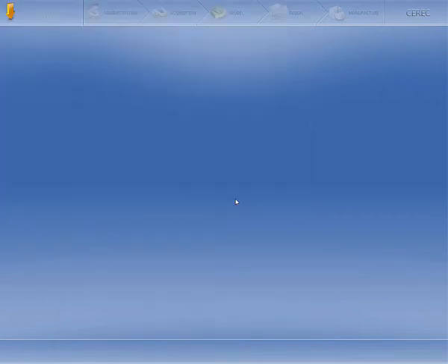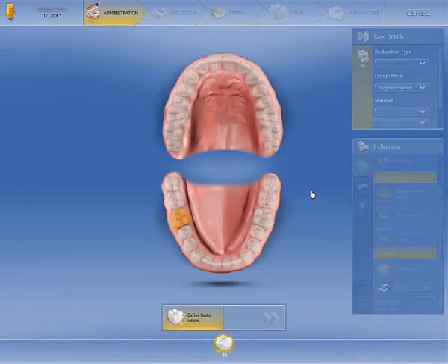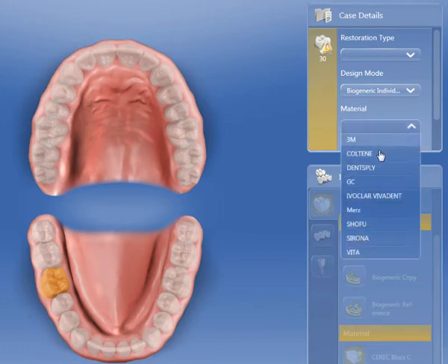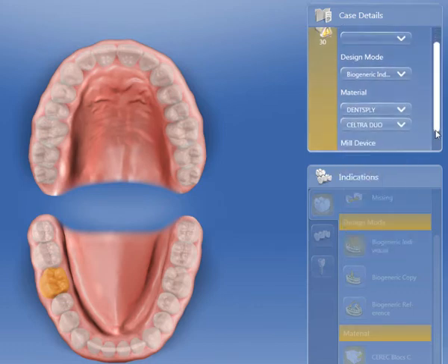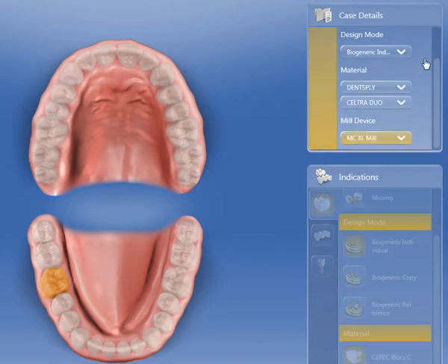You may see a note here that the selected material of the element is unavailable and should be changed — feel free to click OK. In the Case Details pane, we can select our material as well as the milling machine. Click the check mark to save these details.